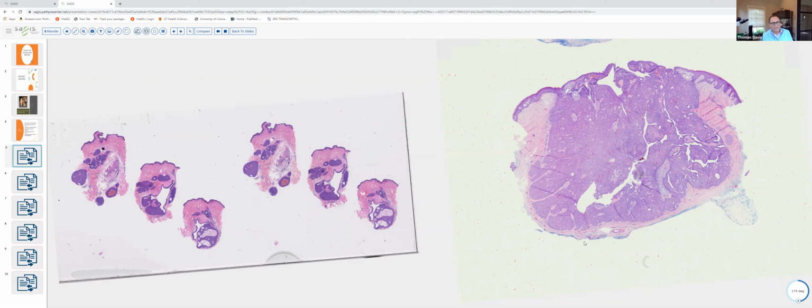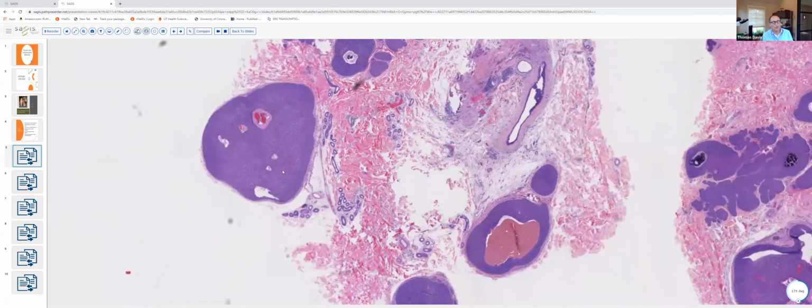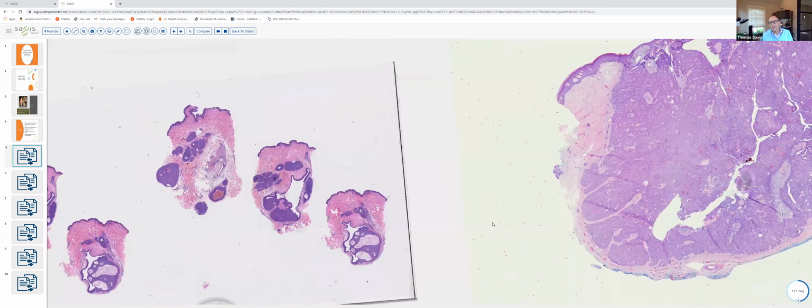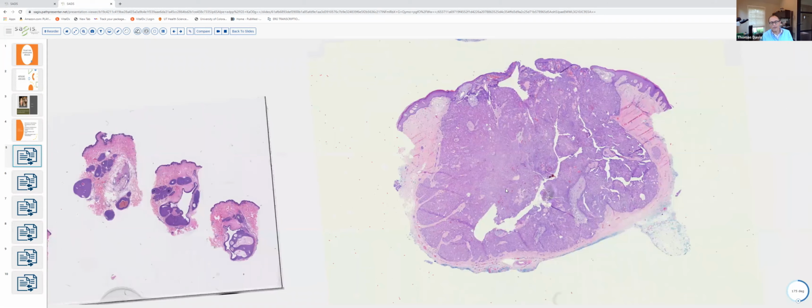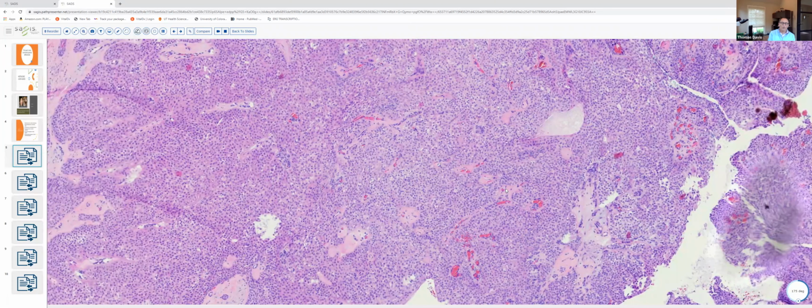Both of them, because they are epithelial tumors, are composed of tumor islands, and the cells making up the tumor islands, both here in our dermal duct tumor and here in the nodular hidradenoma, tend to be very uniform cuboidal cells with pink cytoplasm.